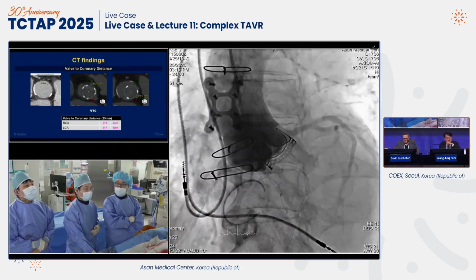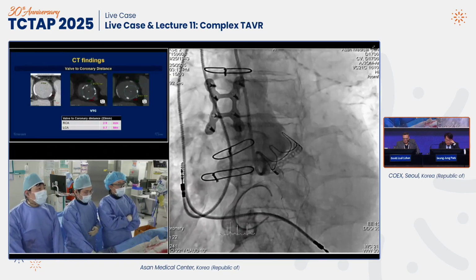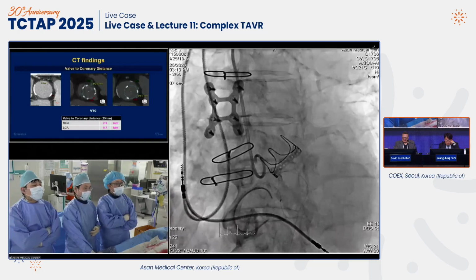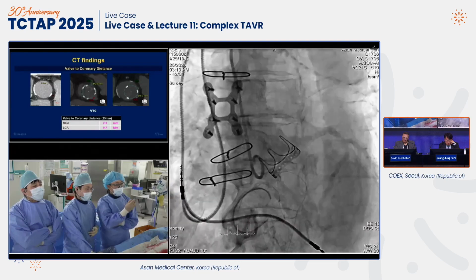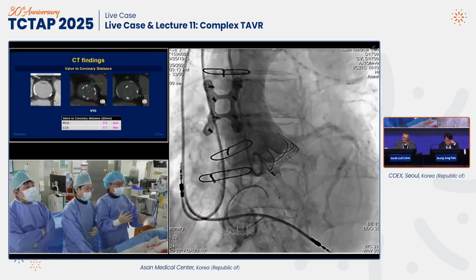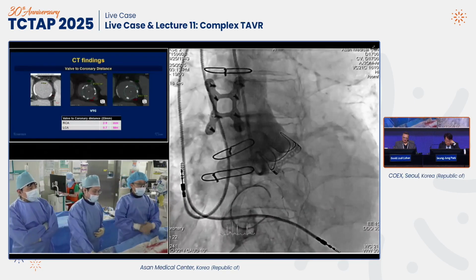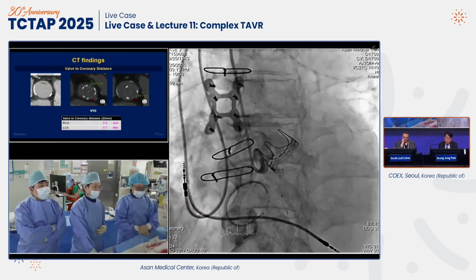There are many considerations. With this patient, most TAVR companies would hesitate to provide their valve. So I think this is absolutely not an easy case, and the VTC is very low, and the prior CE valve was 21, true ID is 19. So I think we have a lot of consideration: basilica or ShortCut or peripheral access. Any suggestion or comment from the moderator and the panel?